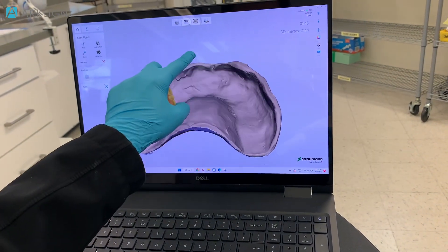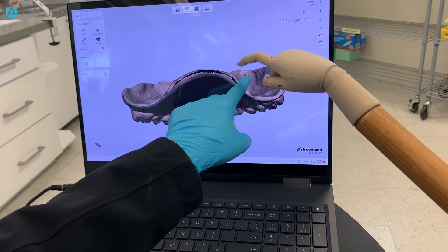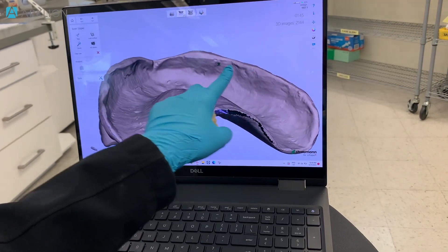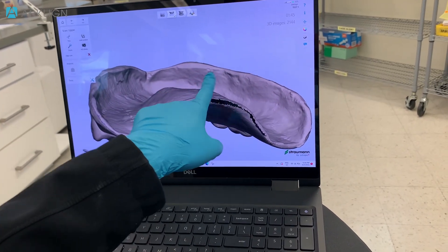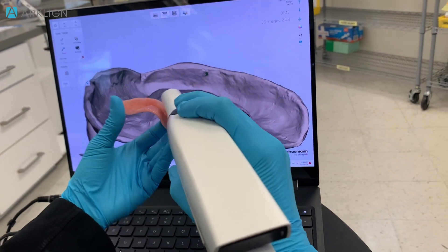So far so good. I'd just like to close up the border a little bit — there's a tiny dot right there. This won't impact the duplicate denture, but if you want, we can go ahead and scan that area. There we go.